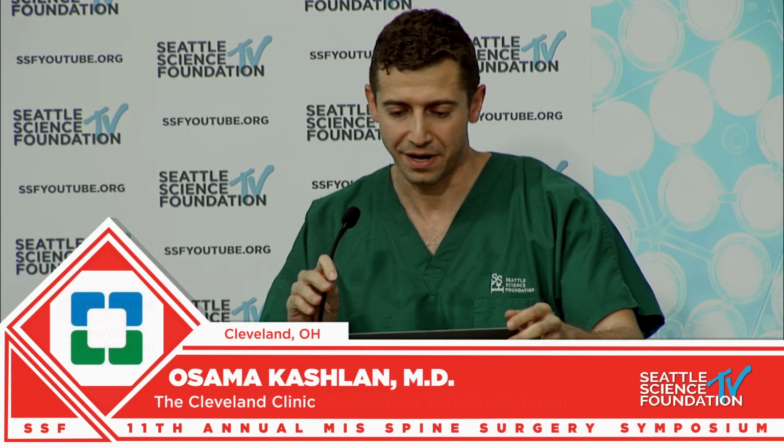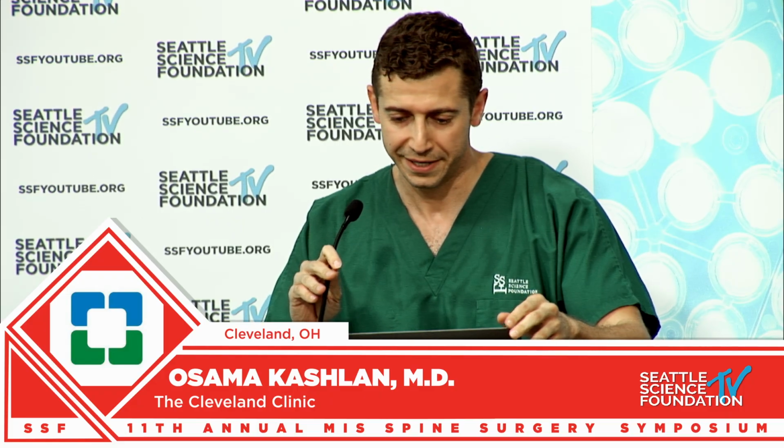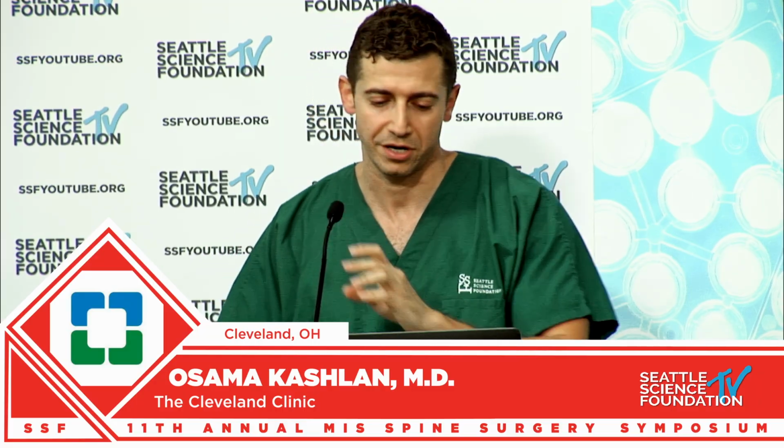Again, my name is Osama Kashlan. I'm now at Cleveland Clinic, but I'm moving from New York Presbyterian. And I'll be talking about Uni-portal Endoscopic Interlaminar Discectomy.